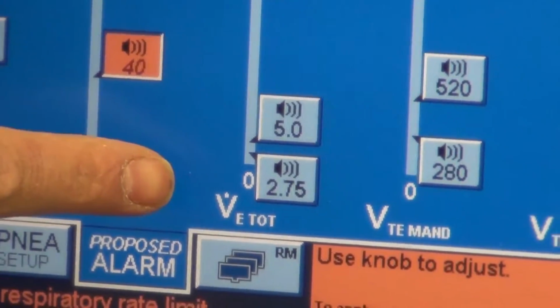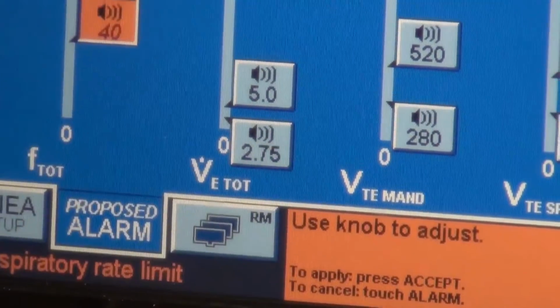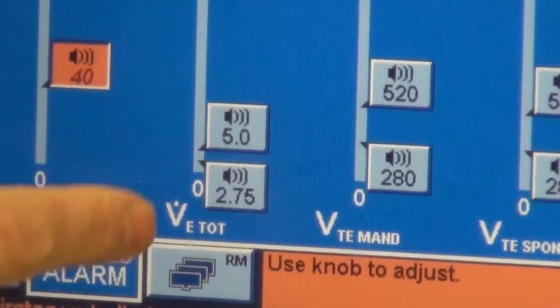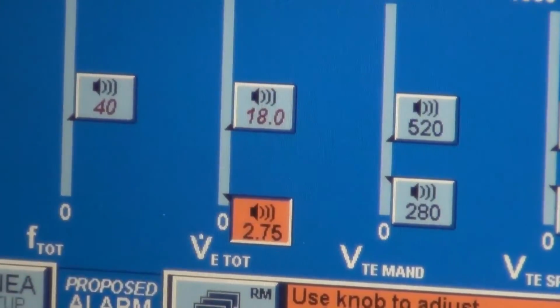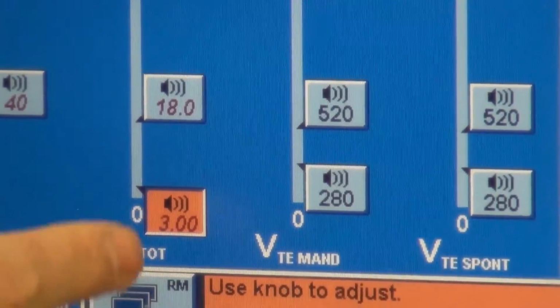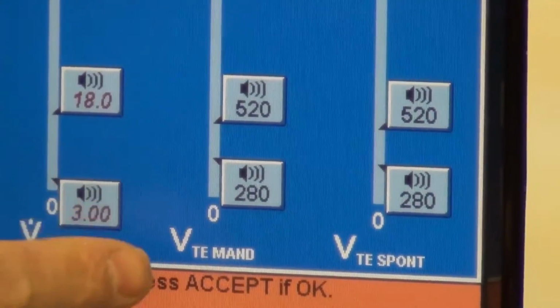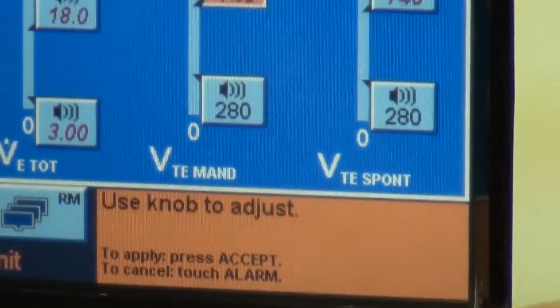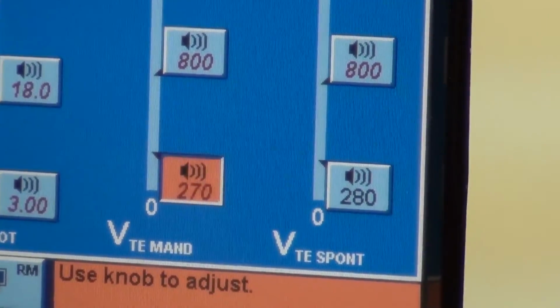The next one is our minute ventilation. Minute ventilation is just measuring how many liters per minute, or how many liters we breathe in a minute. And for keeping it simple, we're just going to go from 18 as a maximum and 3 as a minimum. And that'll be more of a cookie cutter alarm setting. Next one is tidal volume. We're going to do some cookie cutter method here also. We're going to go to a maximum volume of 800 and a minimum of 300.